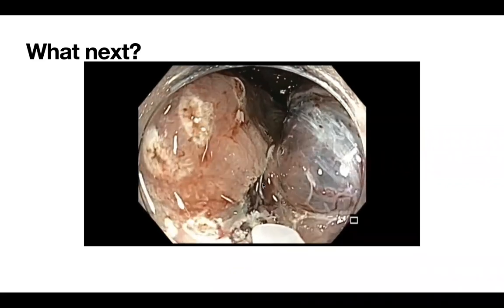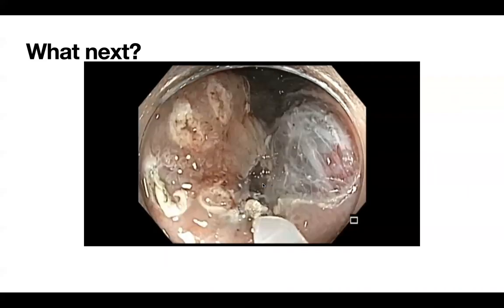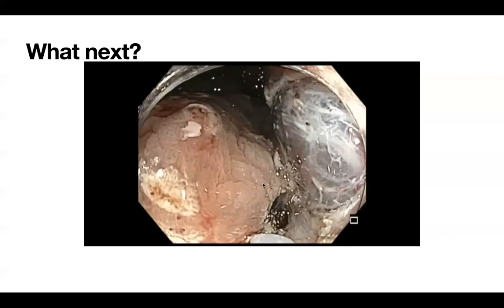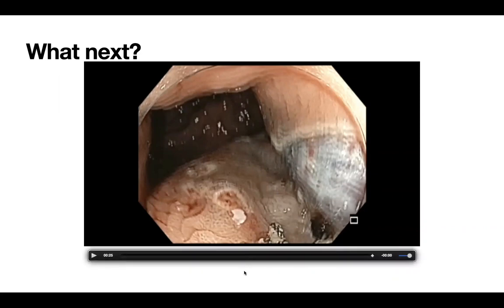That's how I used to set up for all my cuts. But of late, when I was doing EMRs, I started changing the setting on the left side to EndoCut Q and on the right side soft coagulation, so that I don't have to change my parameters in the middle. But in this case, I had to change to force coagulation for the cut and soft coagulation for the coagulation of the blood vessels.